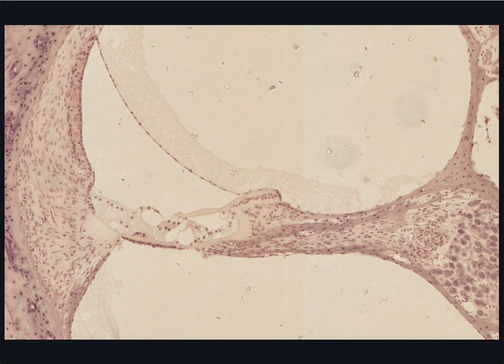The spiral ganglion coils around the inner edge of the cochlear duct. Observe the ganglion cells here. It's a sensory ganglion. And you can also find the acoustic nerve fibres extending from the ganglion cells out towards the hair cells in the organ of Corti.